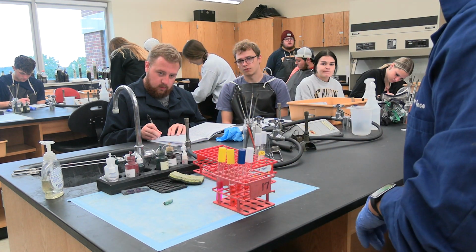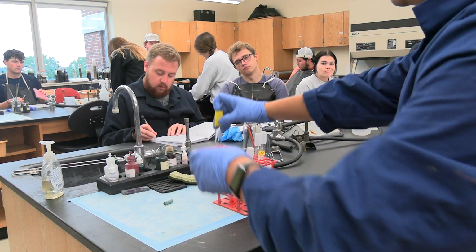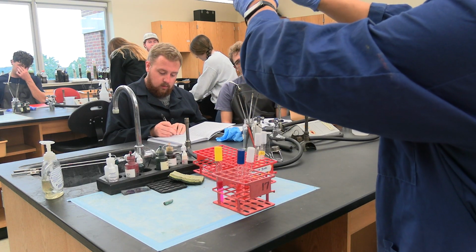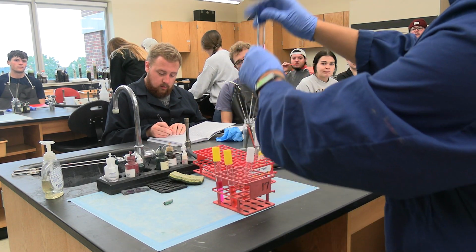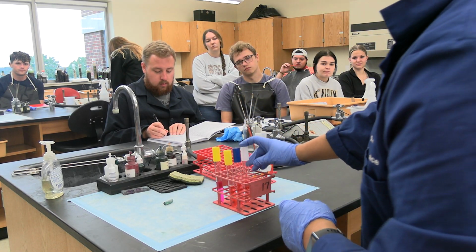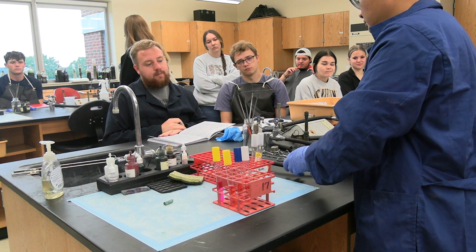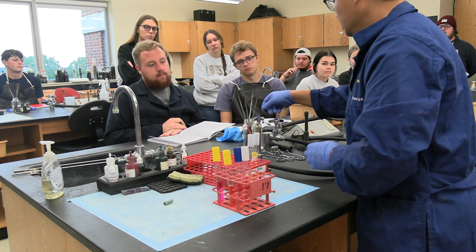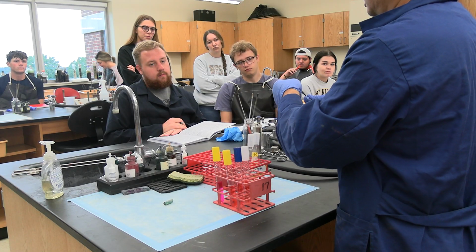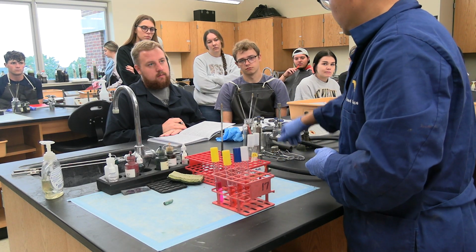Okay, what do we do next? You're going to label on the top, and label on the top, and label on the top. Now how do we do it? Just a very quick demonstration. I think I need to do it because although I think it's easy, some of you are still confused.